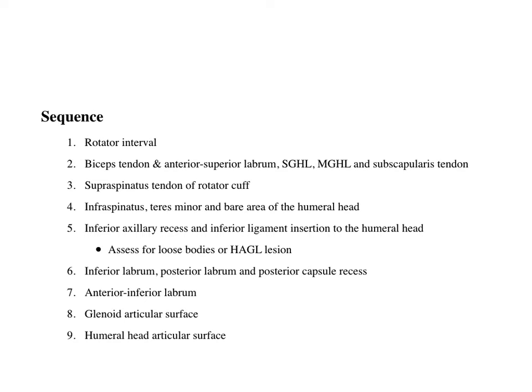Moving on with the diagnostic arthroscopy, I'll try to illustrate with the best of my means through pictures in these following slides how to perform a diagnostic scope, but for anybody who's interested, YouTube has great videos. The usual sequence while performing a diagnostic scope is as follows.